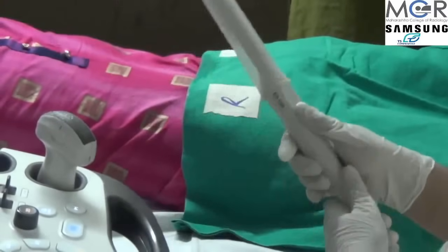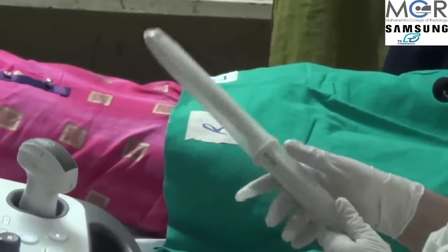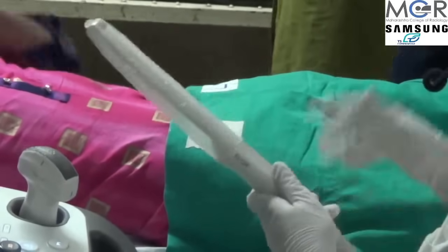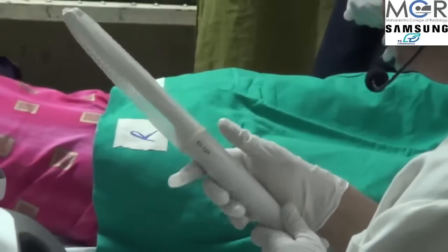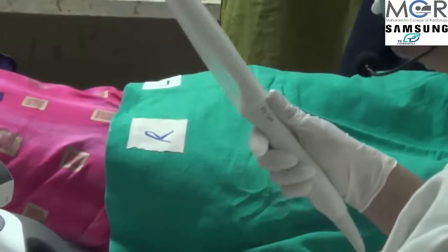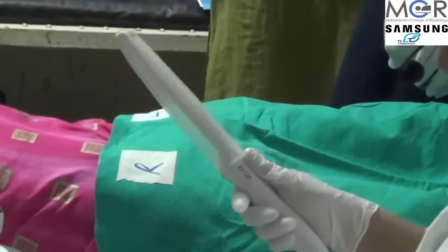There should not be any confusion, otherwise we can miss out. Once we are inside the vagina and we happen to remove our hand from this marker, we can get lost. Once you have placed your thumb on this marker, it should not be removed. This grip should be firm until the examination is complete.